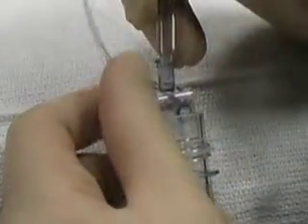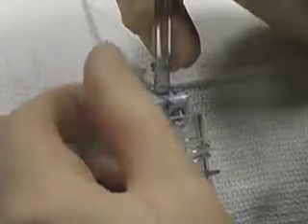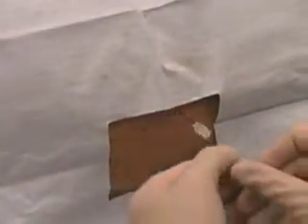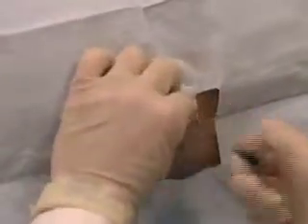By turning the stopcock toward the patient, fluid in the manometer may be collected. After collecting an adequate specimen, replace the stylet and remove the needle.